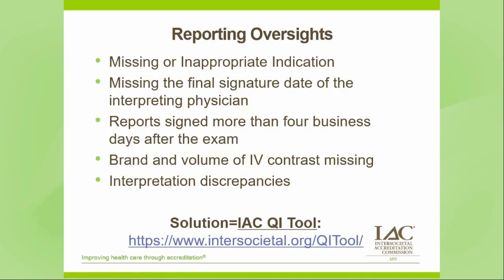Now, the answer to these questions is easy. Use the IAC QI tool. Not only is it free to use, the questions there are the same questions that the IAC reviewers use. So if you use the QI tool, you've essentially turned the report submission into an open book quiz. More info on the IAC QI tool can be found on the website included on the bottom of this slide.